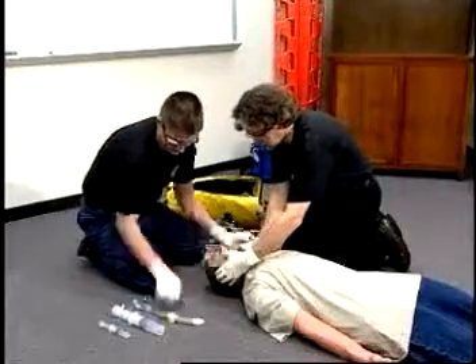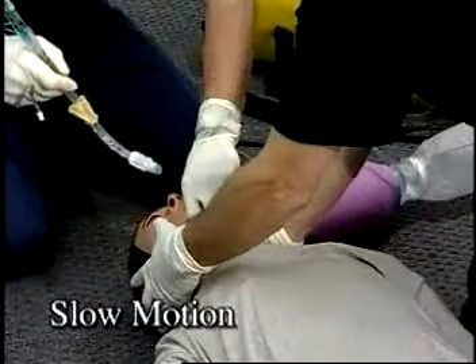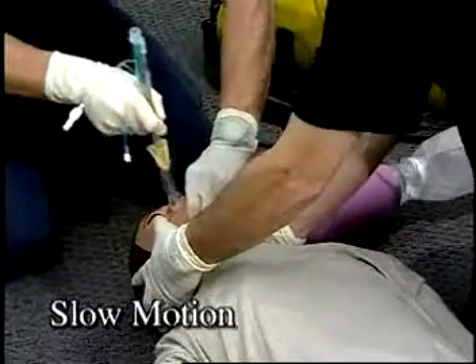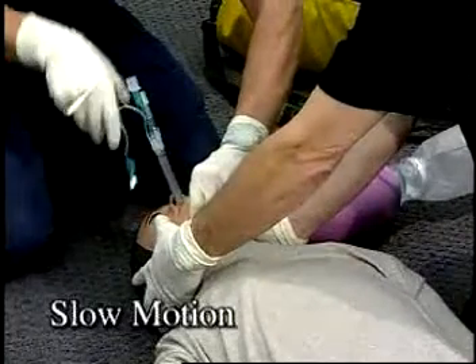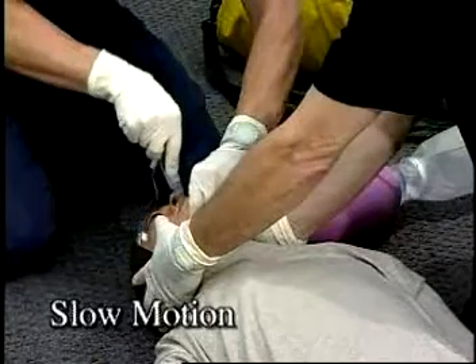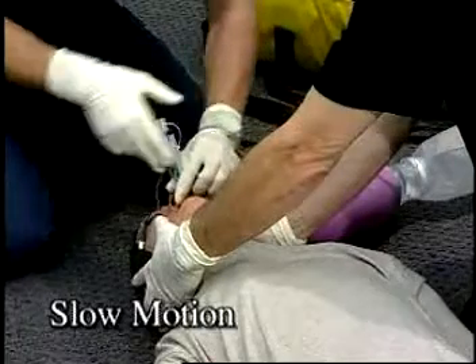Insert the Combitube between ventilations by lifting the lower jaw and tongue upward with the non-dominant hand while inserting the Combitube with the dominant hand. Be careful to avoid tearing the cuffs while passing over teeth or dental appliances. Continue inserting the Combitube until the marker rings are aligned with the patient's teeth or alveolar ridges of the mandible.